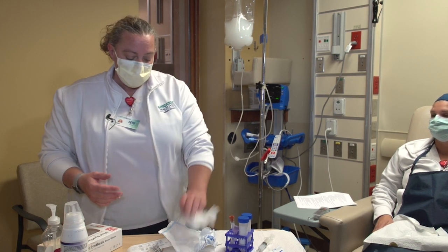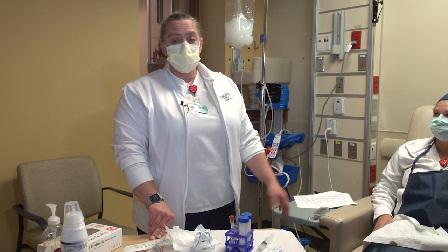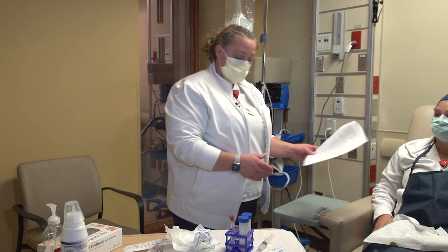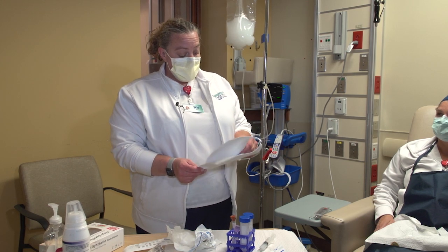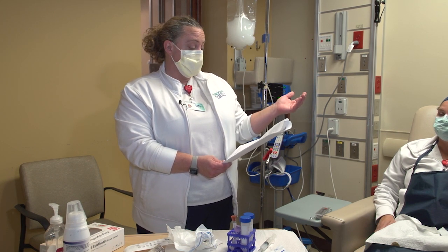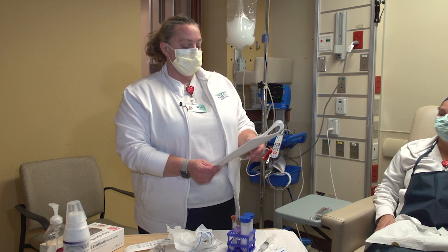While you're waiting for your cell count results, do a dressing change. Look at that exit site so you can see if that needs to be cultured with a Q-tip. Do a dressing change. The cell count takes about 30 minutes for the results to come back. On your SOP, it tells you how to label them, hand deliver them, and put in a .pd cell count smart phrase and send that to your PD home staff.